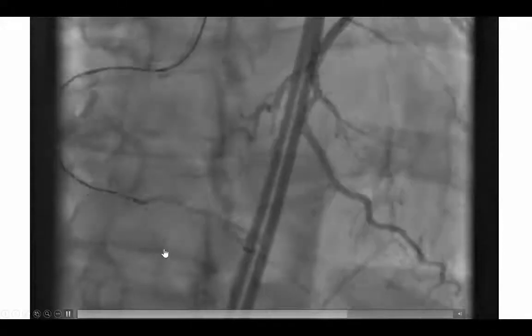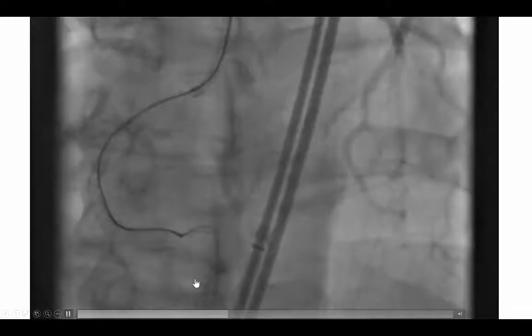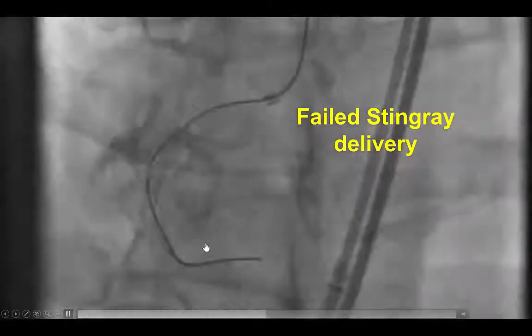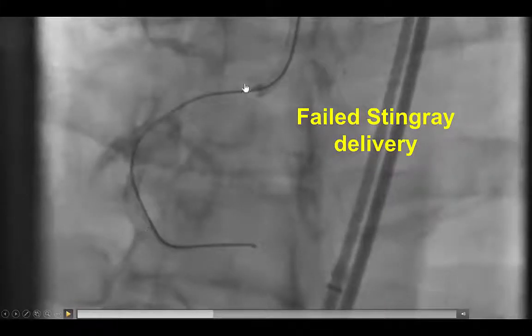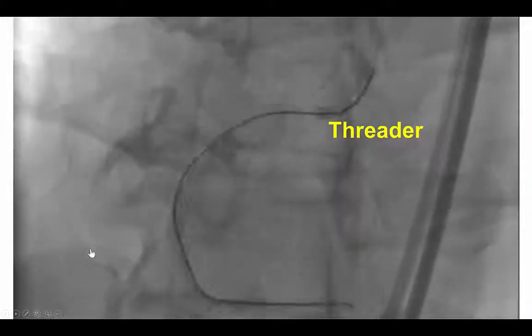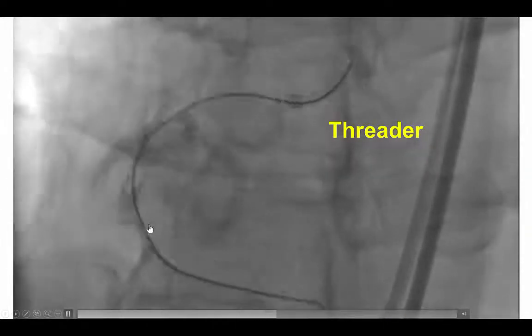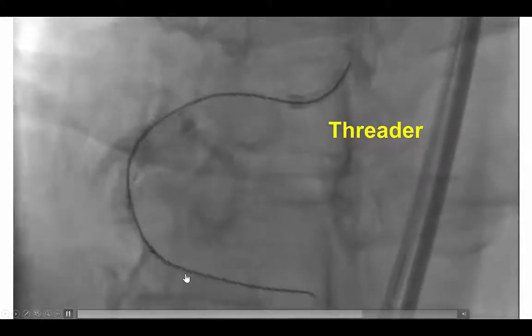We were able to advance the Corsair microcatheter all the way distally, and then changed for a Miracle 12 wire as a rail to deliver the stingray balloon. However, unfortunately, we were unable to deliver the stingray through the mid part of the stent. As a result, we used ballooning with the threader balloon microcatheter all the way from the proximal to the distal part of the stent.